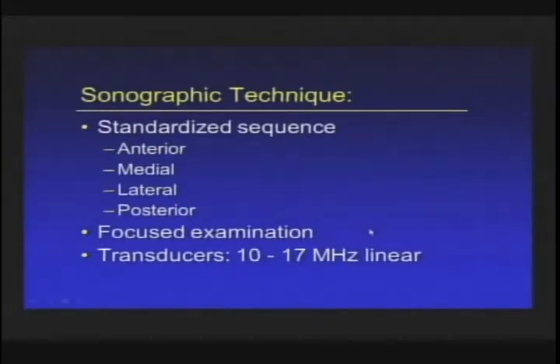There is a benefit of a comprehensive exam. One is that you can deal with referred pain. The second thing is that you become very efficient at the exam. And if you do every exam the same way, you don't go back in the room and think, oh, I forgot to look at this, because you do it on every single case.